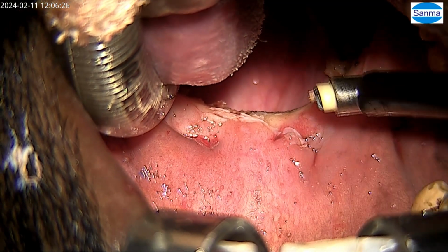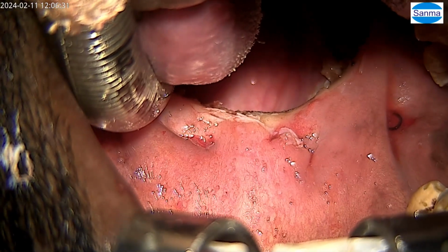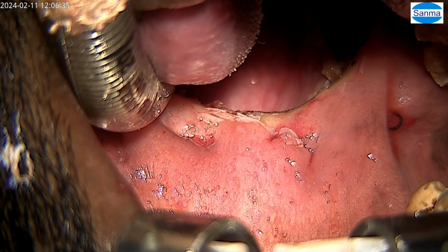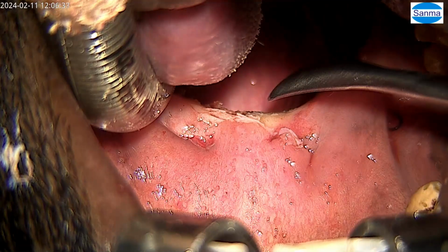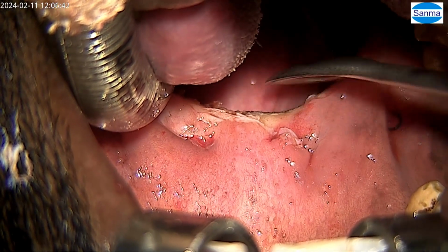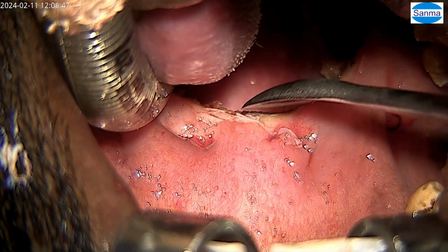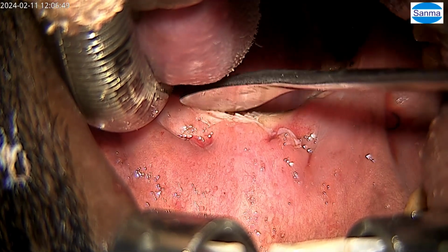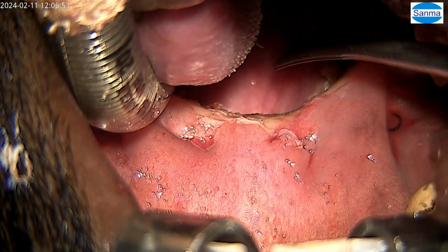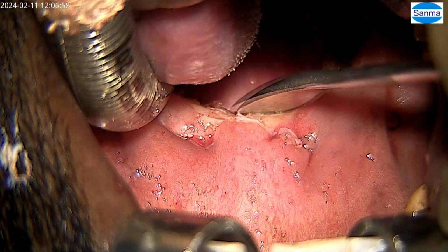Post-operative globus sensation in these patients is much lesser than when you use the cautery. If you use cautery, then it is much more. The globus is more because, see, I'll tell you, sir, this was the soft palate, right? When we use cautery, we make it hard, and when we put multiple sutures, we make it a hard palate. So if you make soft palate hard, you will get globus. Here I have gently cut the soft palate. Obviously, there is going to be a little bit of fibrosis, but with coblation, the fibrosis is least. There is no mucosal loss here, completely preserved.